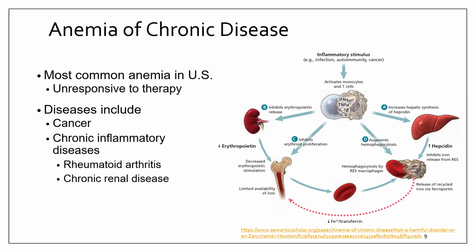Peripheral blood smears typically show normocytic, normochromic anemia, sometimes mildly microcytic. We see a decreased red blood cell count, normal morphology overall, no dramatic shape changes. So translation, the cells don't look terrible, there are just not enough of them.